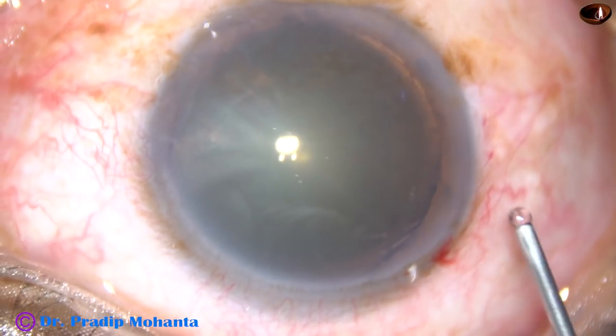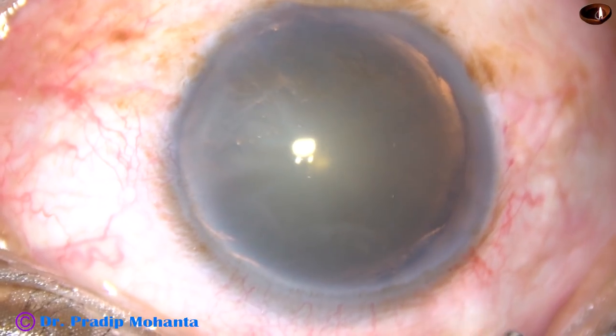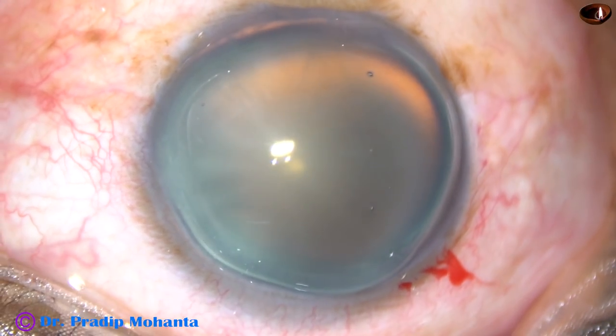Soft cataracts are difficult to hold, so it is difficult to chop. And it is difficult to do stop and chop or divide and conquer technique for these kind of cases.